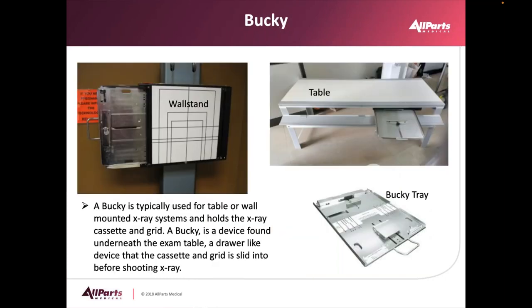Within many of the positioners, there's a device called a bucky. The bucky was originally used to mount a cassette with X-ray film in it. But in today's system, the bucky is being used to correctly position a digital detector under the patient or behind the patient.